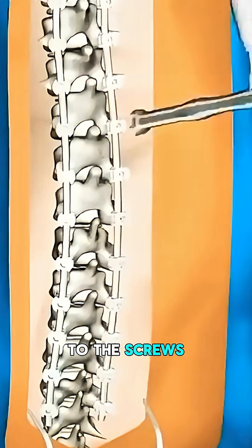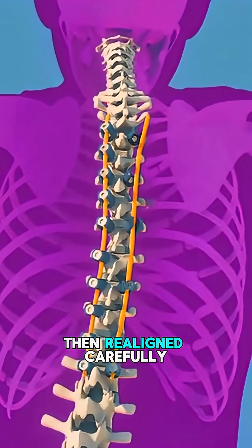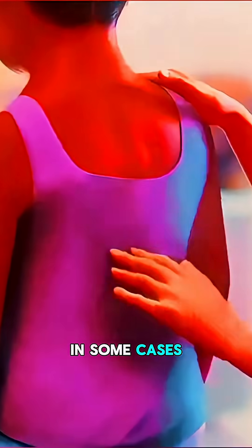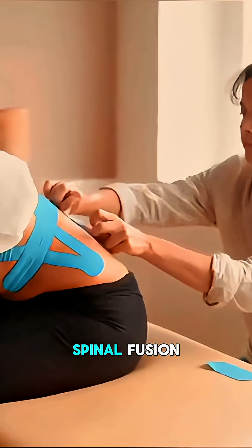Rods are attached to the screws to straighten and stabilize the spine. The spine is then carefully realigned using the rods. In some cases, bone grafts or synthetic materials are placed to promote spinal fusion.